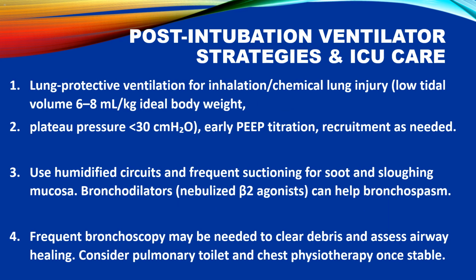Post-intubation ventilator strategies and ICU care in burn inhalation injury. 1. Lung protective ventilation means using smaller tidal volumes, 6-8 ml per kilogram ideal body weight, to prevent further lung damage caused by overstretching fragile lung tissues. 2. Keeping plateau pressure below 30 cmH2O protects against barotrauma and minimizes ventilator-induced lung injury.